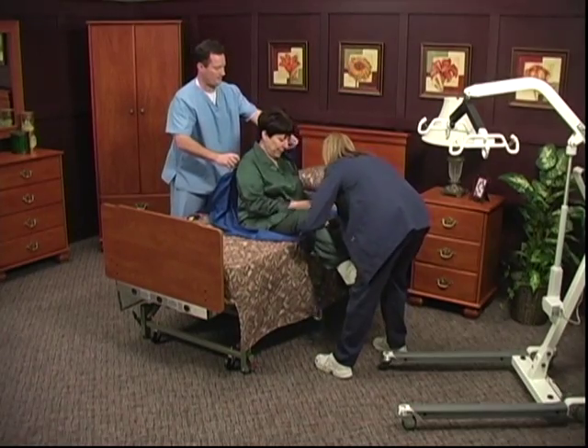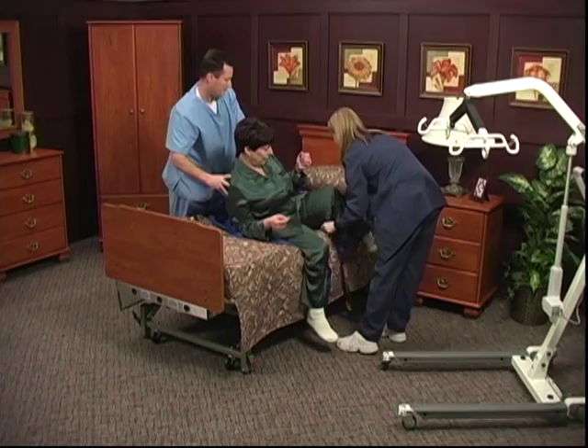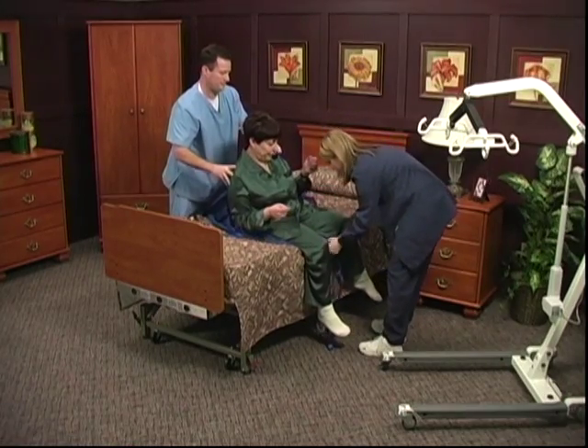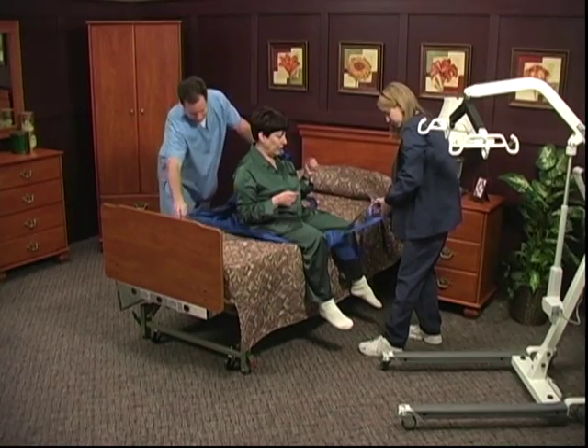These are essentially the same, except for the weight limits. Our LF-1030 hydraulic lift functions the same way. Hydraulic lifts are primarily used in home care and have Medicare reimbursement.